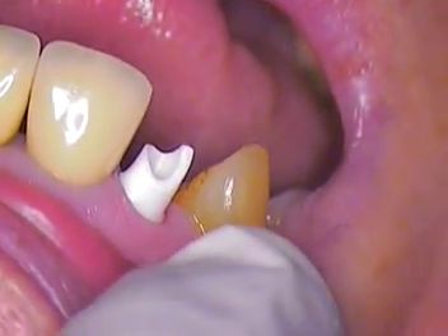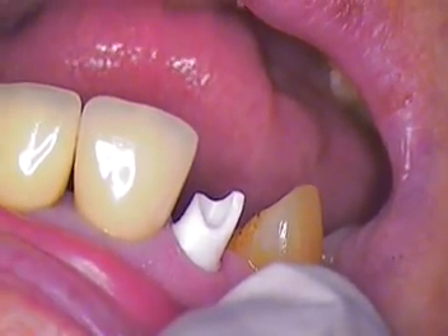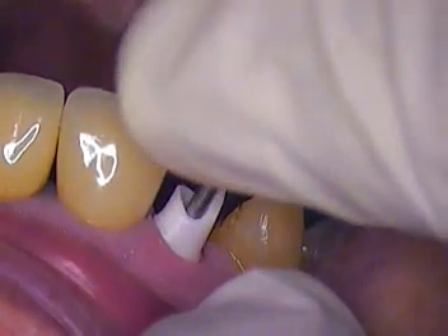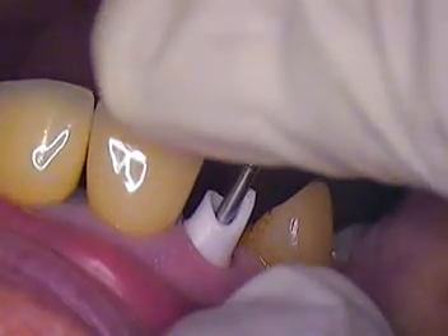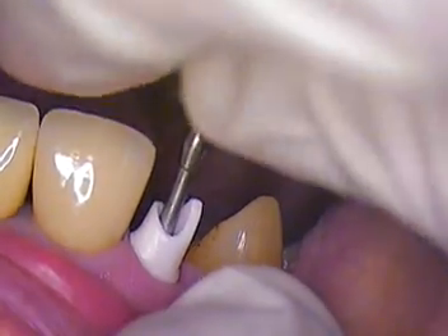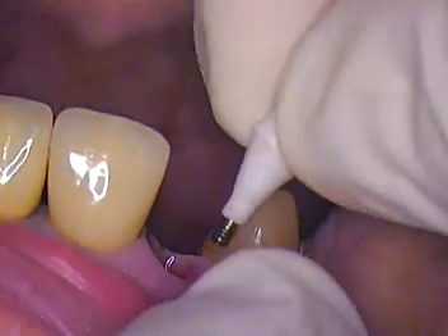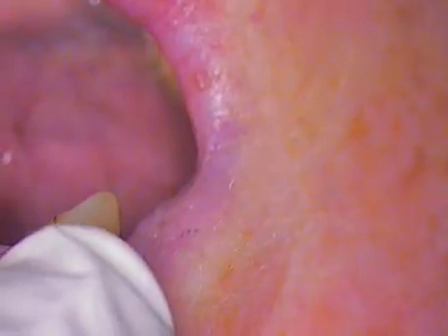This is number seven and we're back in here. I'm just going to undo this to look at that tissue and I'm going to use the microsuction again. So this is our stramen. We still have to torque it down but this is what we call the ceramic abutment — it's all ceramic. It's amazing, the biocompatibility of having a ceramic abutment.